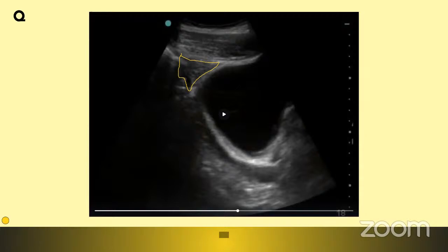This area is hyperechoic compared to the fluid, to the urine here. However, this is much more hypoechoic compared to the walls. This is the lateral cystic shadowing, which we saw as an artifact. This is posterior acoustic enhancement in here. So for easy purposes, this is where we are having fluid right now.